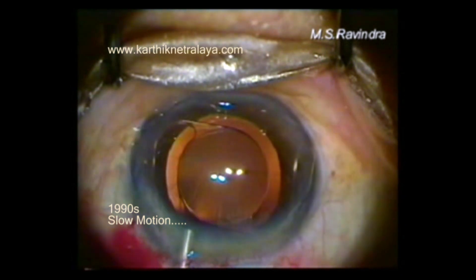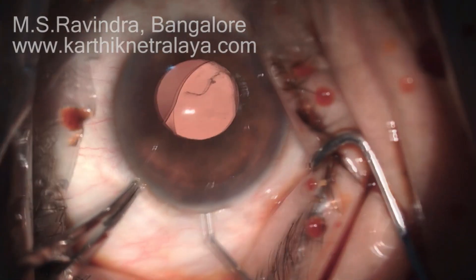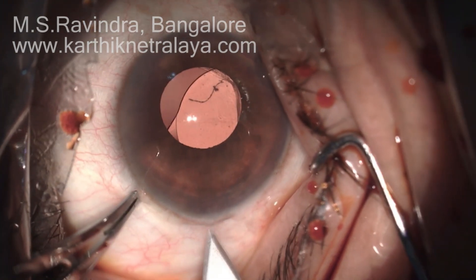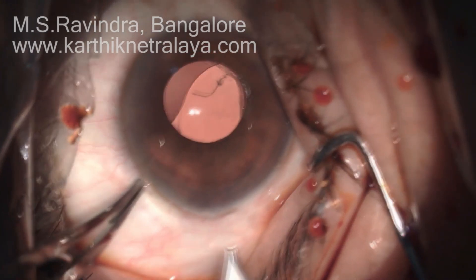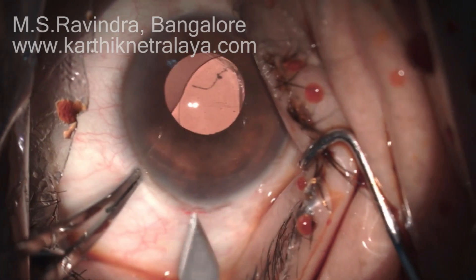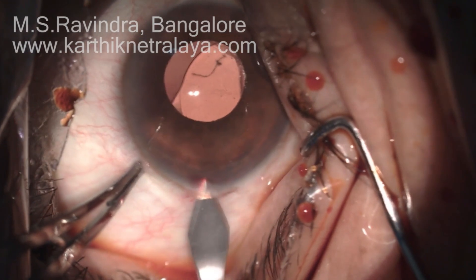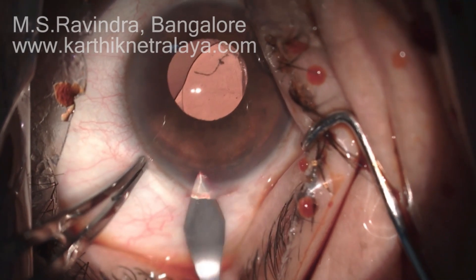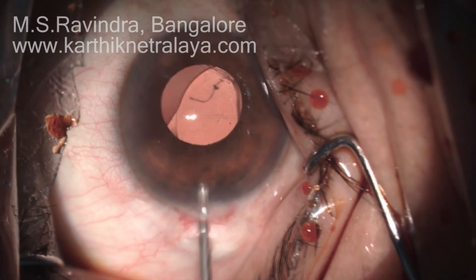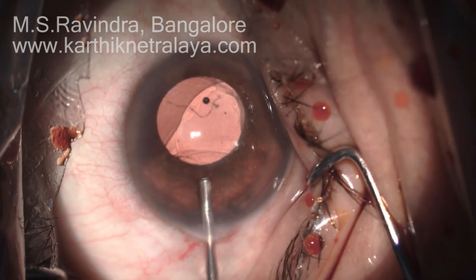The patient will certainly need anti-inflammatory drops for a longer time after surgery. In another case, a couple of weeks after surgery you may notice the lens is not stable in the eye. The patient had already undergone vitrectomy during the primary procedure and the lens is not well supported in the sulcus area — it is decentered. It's a sclerocorneal tunnel, a short scleral tunnel, and it's very difficult to re-open even a few weeks after surgery.